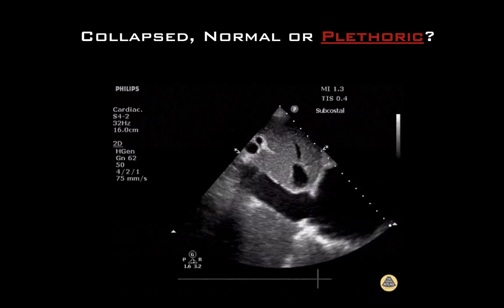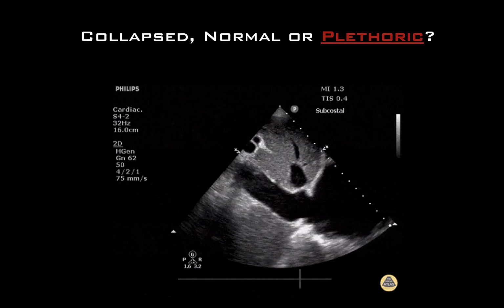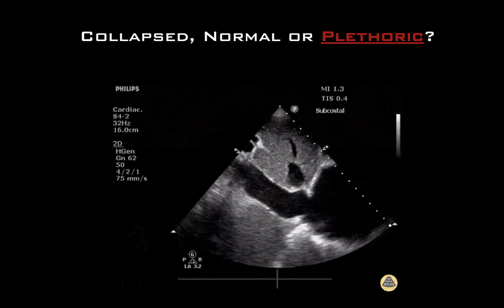In the young patient with sudden onset pleuritic chest pain, there was a significantly enlarged RV in the context of a hyperdynamic LV, and this is the case here of that plethoric IVC. This was in keeping with an acute PE. Always clinically integrate your findings and avoid anchoring decisions on isolated findings.